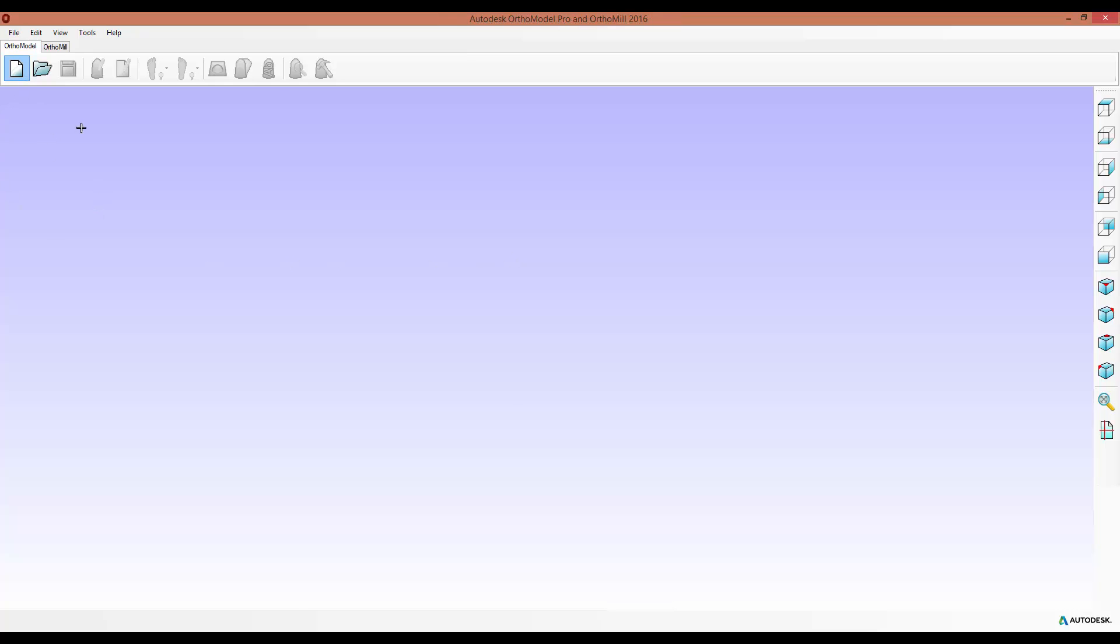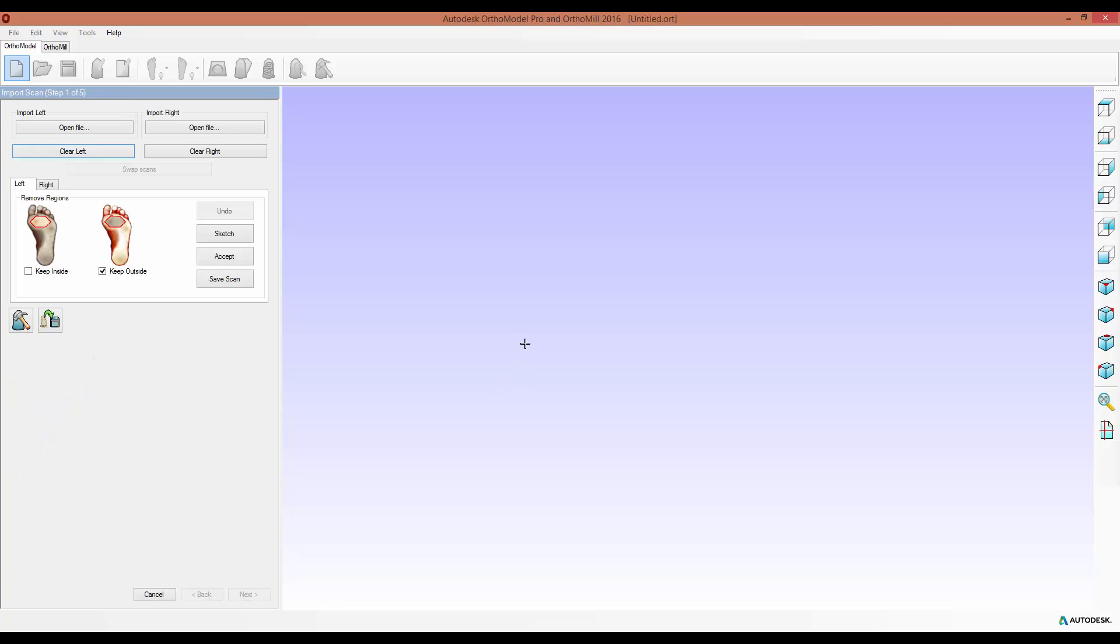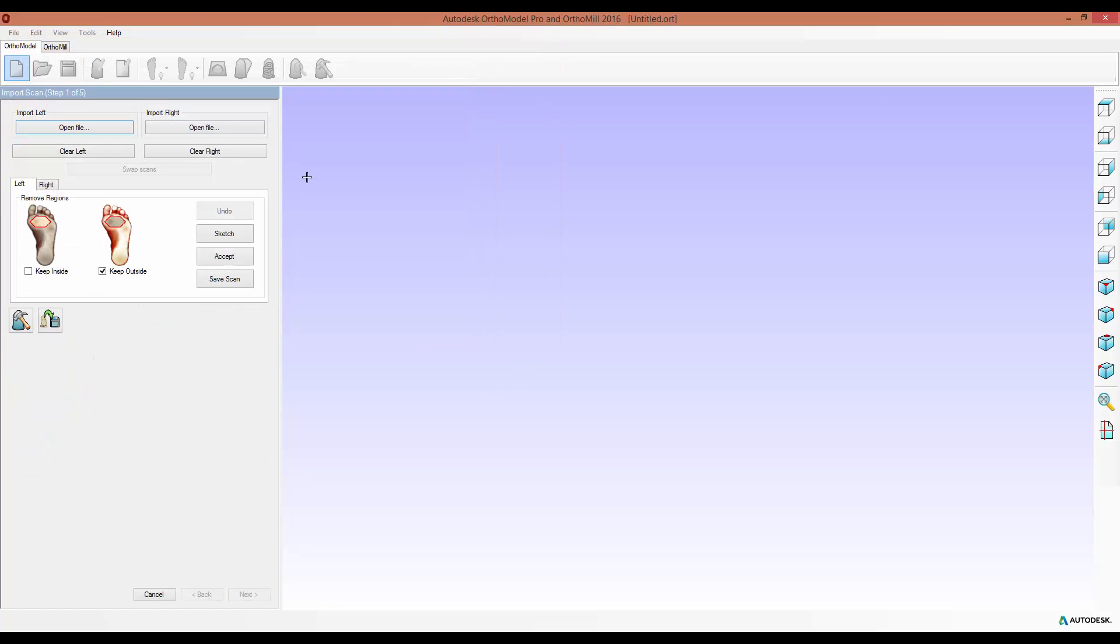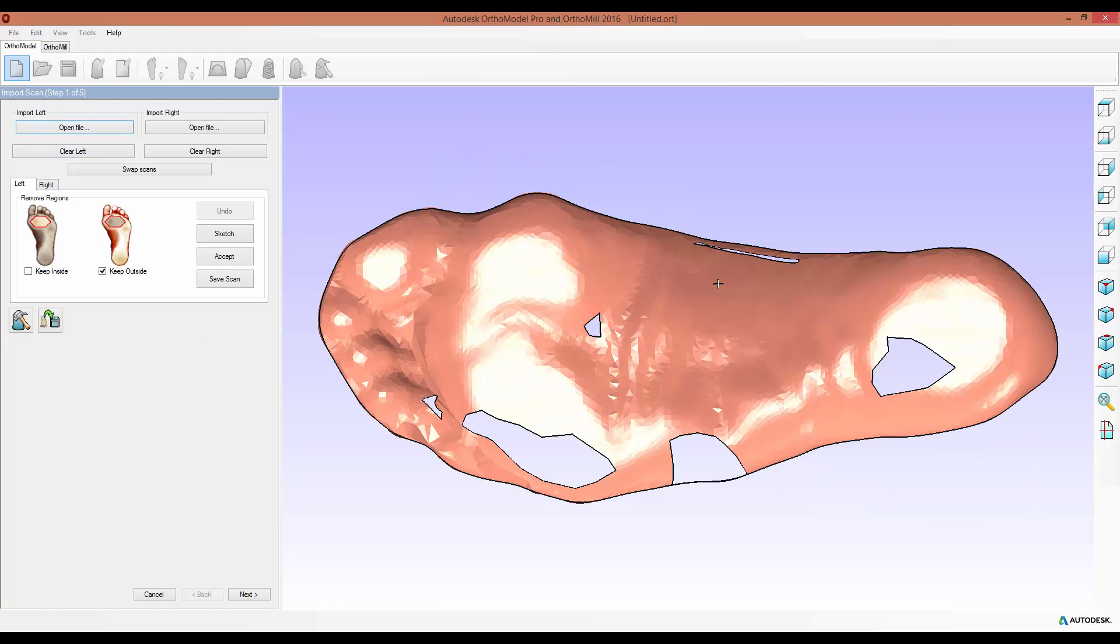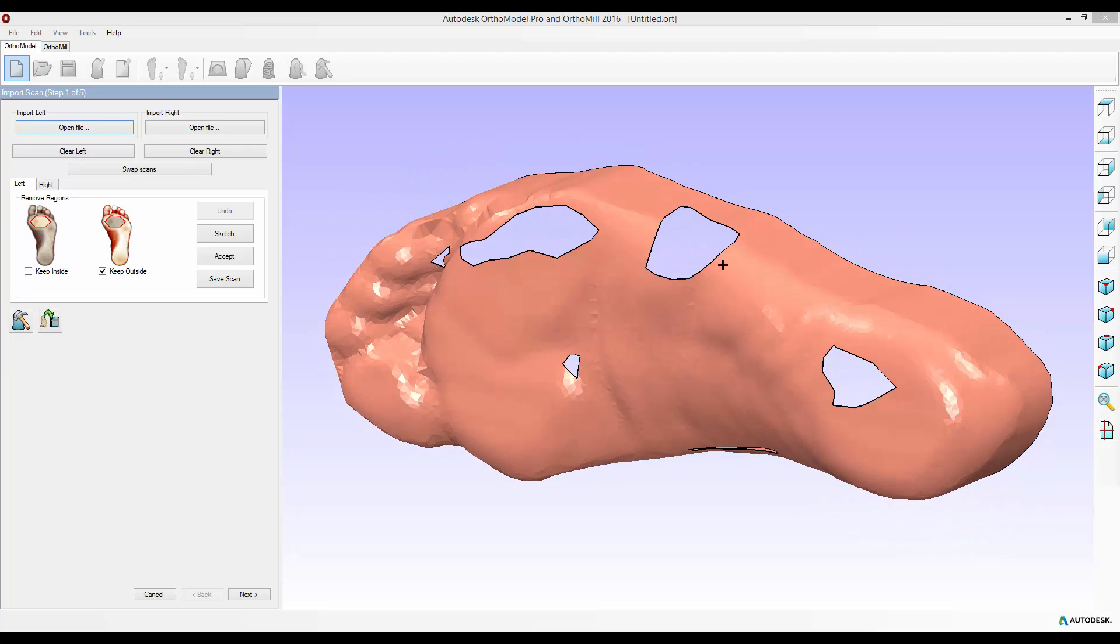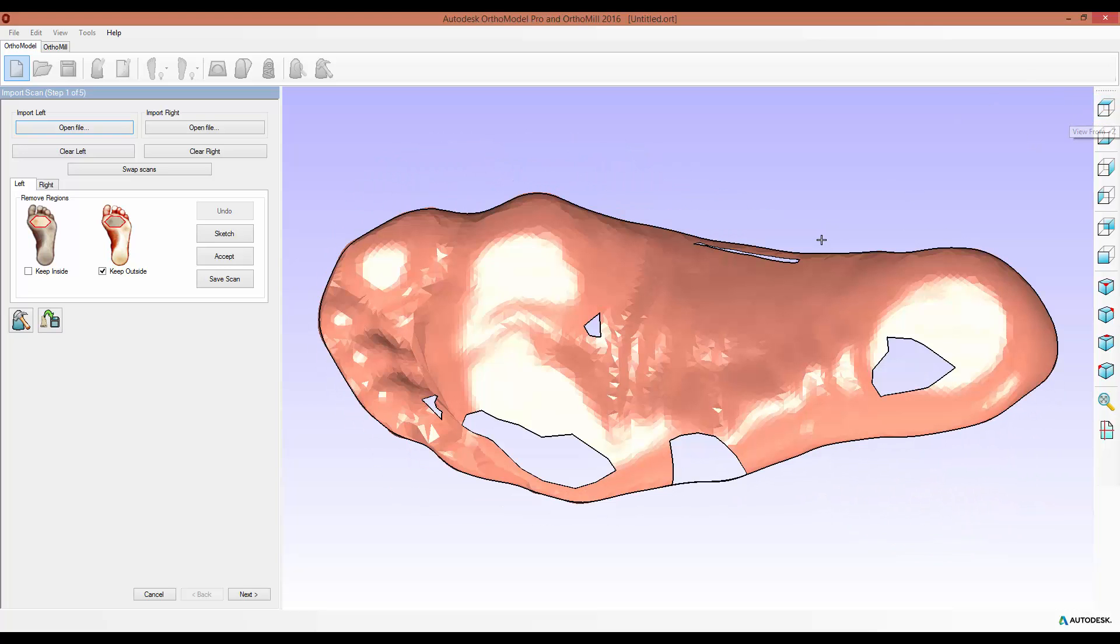I'm just going to create any new job. I'll select anatomical orthotic for now and import a scan file. This one contains a number of errors so there's holes in the scan data, there's some larger triangles around the forefoot, things which we can edit.